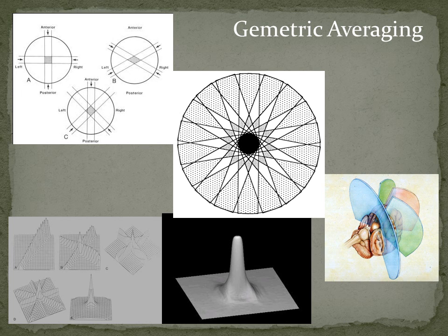The way we accomplish this in linear accelerators is that we actually arc the beam, we spread those entrance doses over the 2 pi of the patient's head, and by spreading those beams out, we get to actually practice this and get these very, very high doses and then get these very rapid fall-offs. In order to do this, you have to use a lot of radiation beams. We have to cover about 500 degrees of arcing head separation. And you'll see that when we do the plans. We have these standard 5-arc plans that use 100 degrees per arc over 5 arcs of radiation. So you need somewhere in the 450 to 500 degrees of arcing over the patient's head to get enough of these beams in to create this very, very steep distribution.